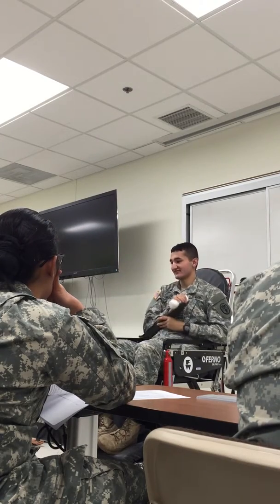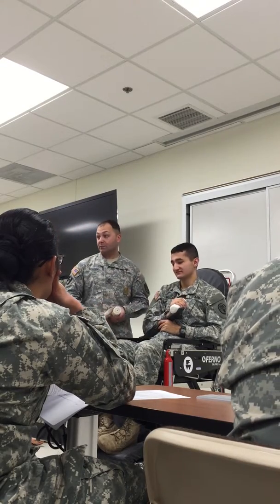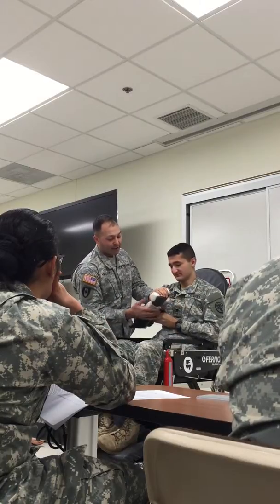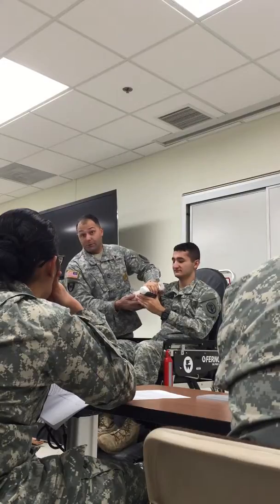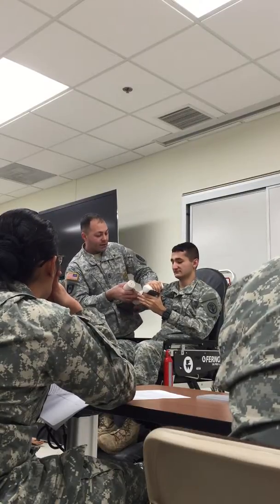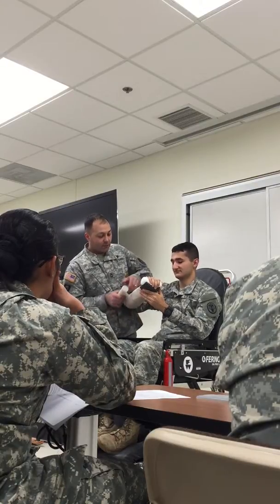Now, the easiest way to do it is, now that the patient's arm has been splinted, you take your ACE wrap and you apply your ACE wrap. I have control of your arm, not causing further injury. Apply the ACE wrap. Make sure to support it down. Okay, good, you're supporting. I'm immobilizing the arm.